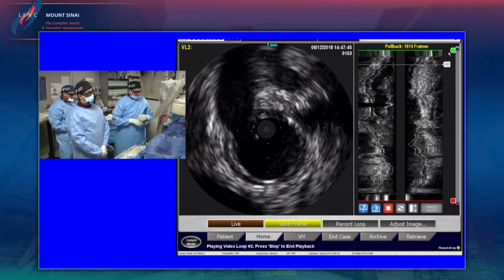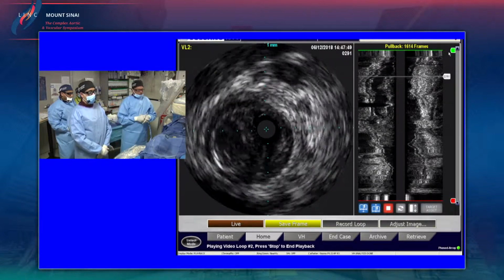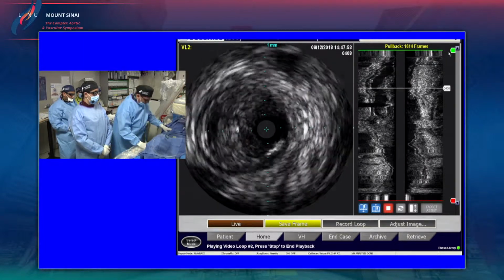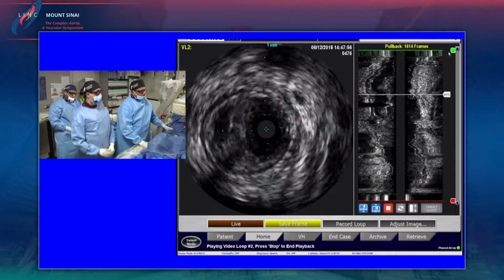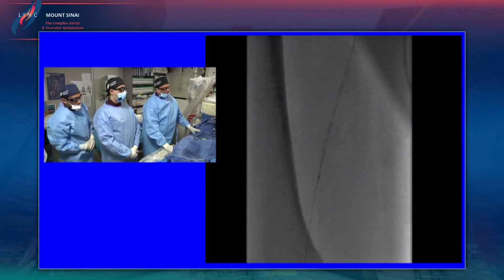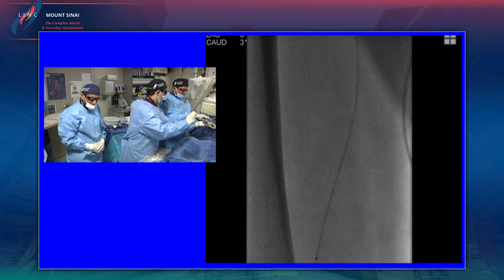So Chris, I think we have to go to another lecture. We have one more lecture, I think. So what we're going to do here is I agreed with Dr. Biamonino because we have a filter in place. So what I decided to do was to go ahead and place a chocolate balloon. This is a chocolate balloon, and I think what this is going to allow me to do is expand this mixed bag, including fibrosis.